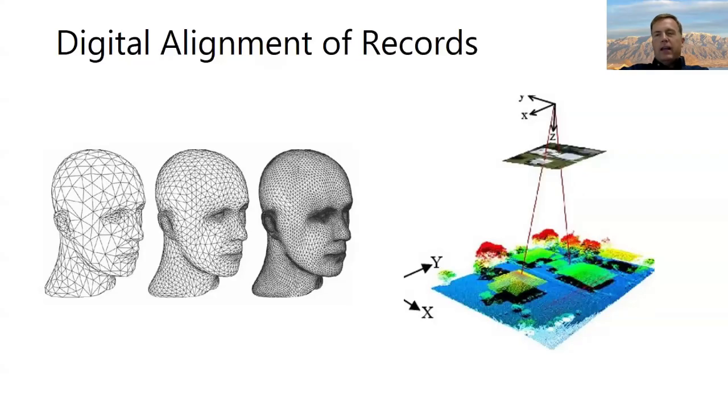So let's say you're taking reference scans for a case. You start with the mandible, you take your occlusal, lingual, buccal, you see the file created, and behind the file, there's an origin point. So the software takes one picture, takes another picture, compares, finds common areas, and gradually by stacking them up, builds that three-dimensional image with a common origin point. So now you've flipped to the maxilla and you get the same result.